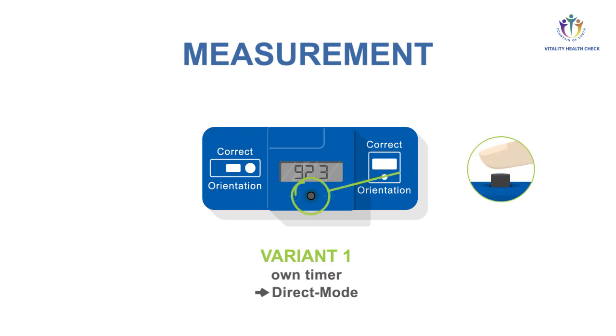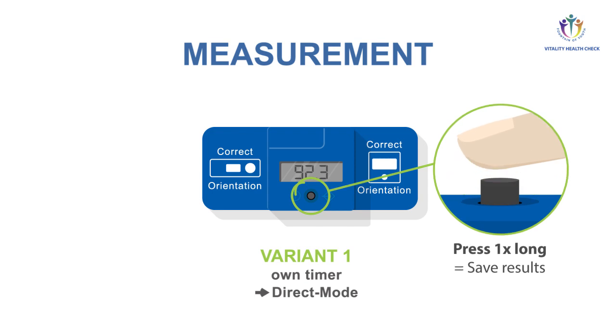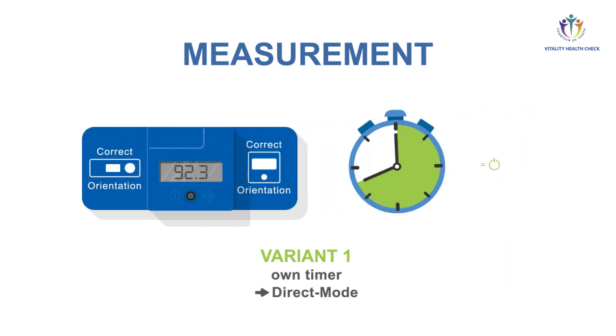Results can be saved by a long press of the button. The VHC reader turns off after 50 seconds. In timer mode, results are saved automatically.